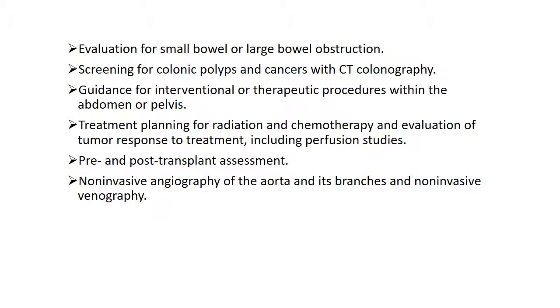Treatment planning for radiation and chemotherapy and evaluation of tumor response to treatment, including perfusion studies, and CT is great again, as we said before, about being able to look at tumor size and see about tumor spread, so you can see whether or not radiation or chemotherapy is working on the tumor, and also you can see if there's any recurrence of it, any growth of it, any shrinkage of it, etc.